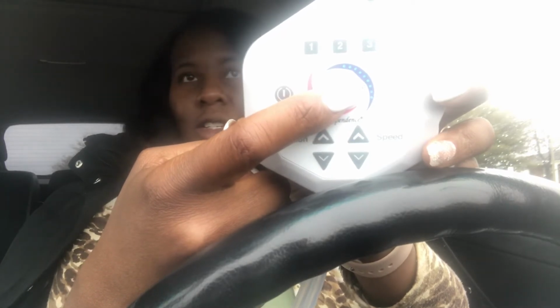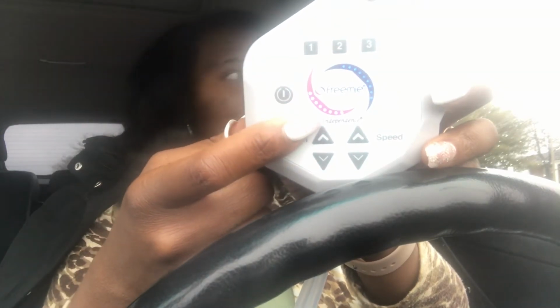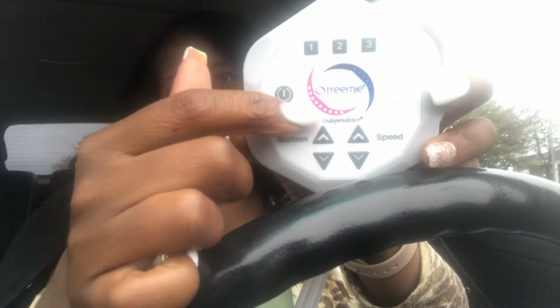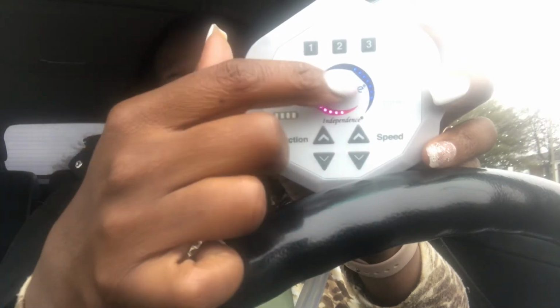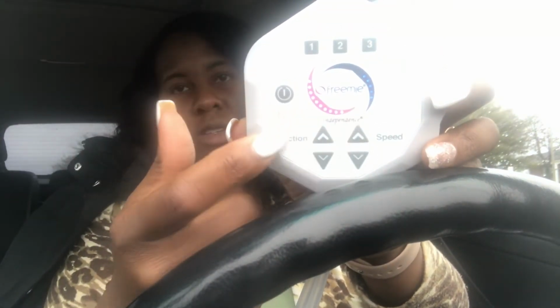That's to mirror the baby's initial suckling, which are quick sucks and not as deep. I do that to trigger letdown, and once that starts, then I'll go ahead and hit my number 2, which, as you saw, the light went up, is a stronger suction and a slower speed to mimic how the baby would start to feed after the letdown started. Those longer, slow sucks. And sometimes I will go to 3, which is more intensified. High suction, even slower speed, because the slower the speed, the more suction you get.